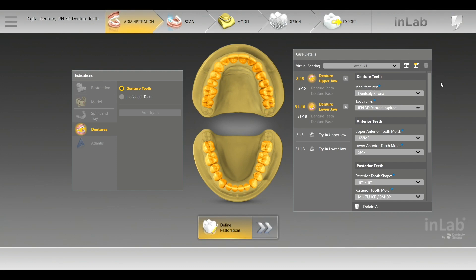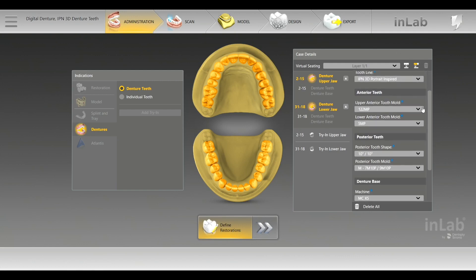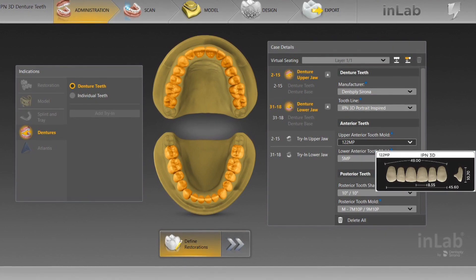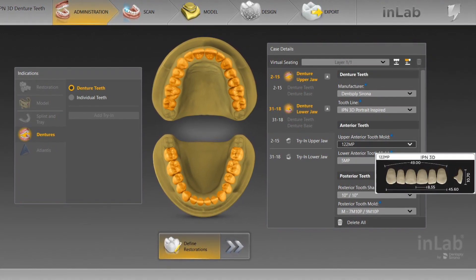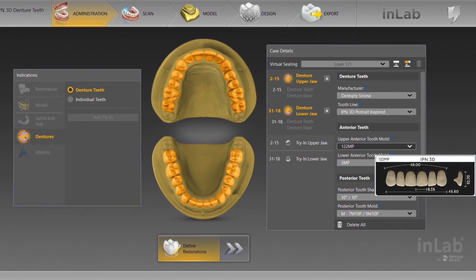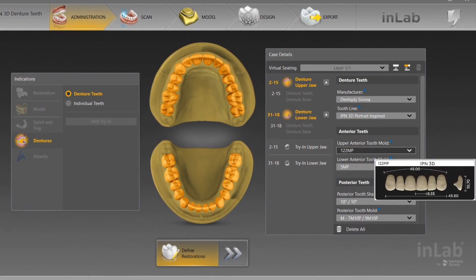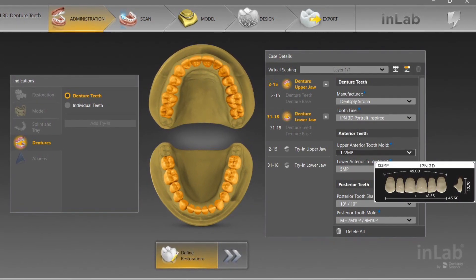Here it looks just like normal administration if you're used to the in-lab software. We're going to be doing denture teeth. In this selection, you're able to choose your tooth mold — it's pretty amazing. You're able to actually choose the tooth mold in administration and it'll show you the length, incisal edge — basically a living tooth mold guide in administration. So that saves you the time of having to pull out your paper tooth mold guide to guesstimate.